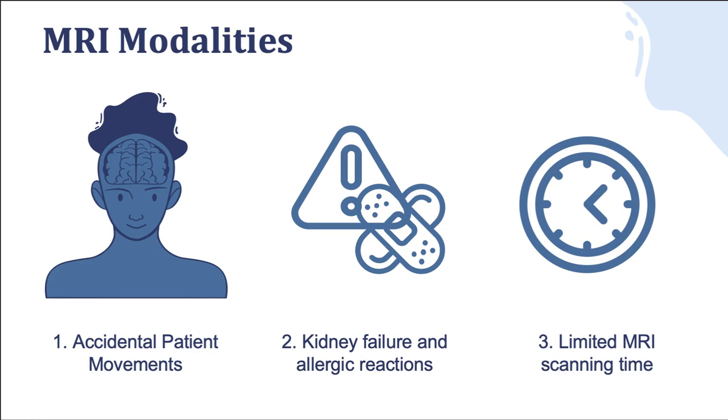However, it is frequent in clinical practice that the patient might have some missing modalities. This can be due to accidental patient movements that cause noise, artifacts, and low quality, and systemic errors in the images. Patients with kidney failures and allergic reactions also miss the contrast-enhanced T1CE modality since they cannot use the contrast enhancement agent gadolinium due to their pre-existing conditions. Limited MRI scanning time also causes patients to lose the FLAIR modality, as that modality requires the longest scanning time.